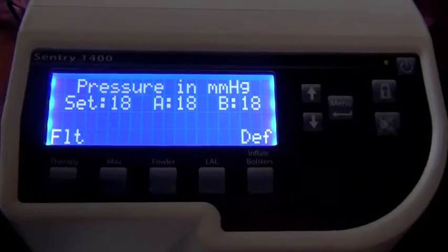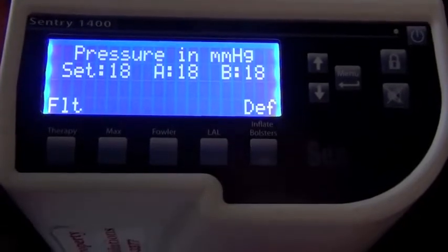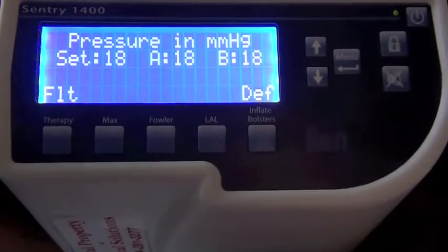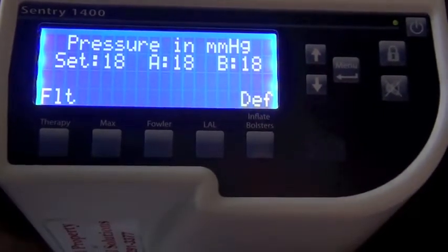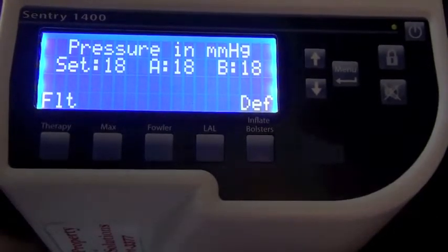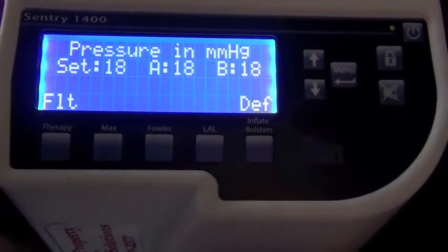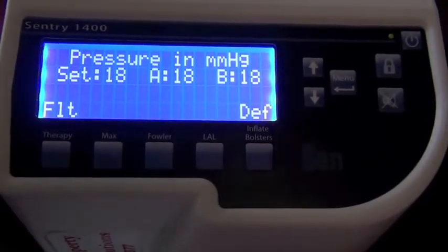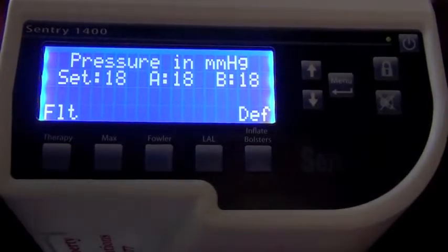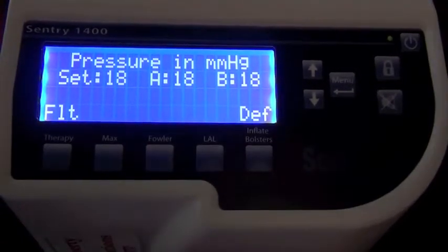Once we have the weight entered, then we have to make some selections based on our therapeutic choices. And again, I go back to the Braden scale. The Braden scale, in terms of activity and mobility and sensory perception, are going to steer you towards this product more so than they would to a product like the Roho. Primarily because if the patient is not moving, if they're relatively immobile, if they're insensate because of diabetes or a stroke or some other underlying comorbidity, we need to offload tissues.